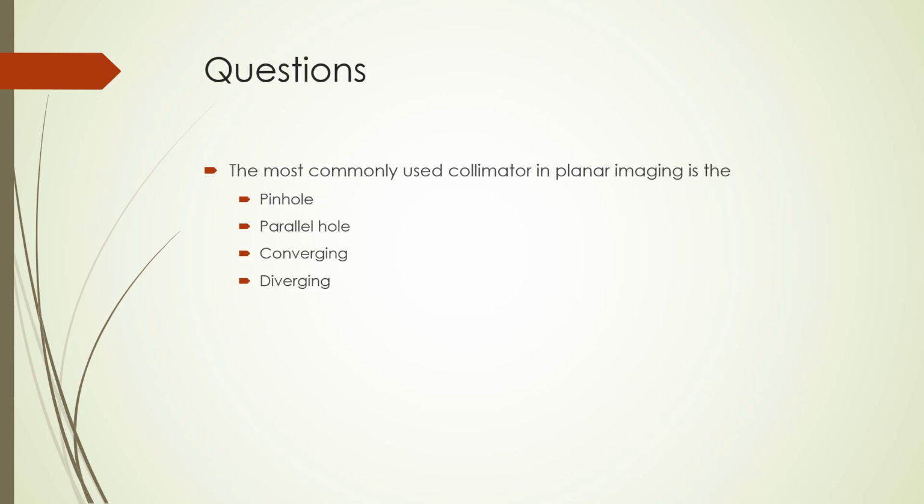Let's finish up with a few questions. First question, the most commonly used collimator in planar imaging is, and your choices are pinhole, parallel hole, converging, diverging. The correct choice is parallel hole collimator.